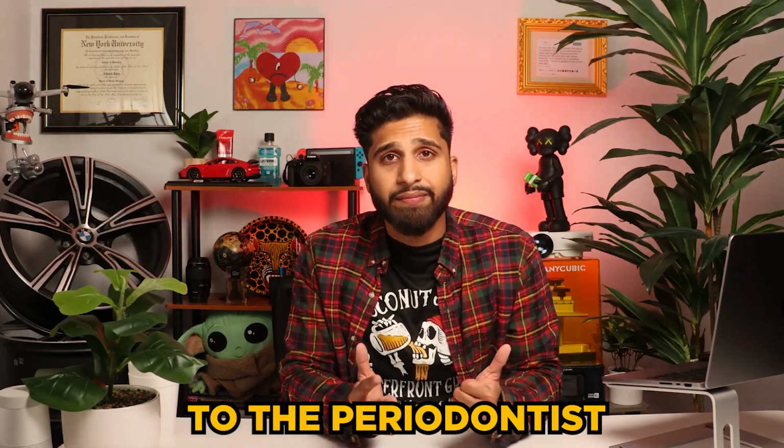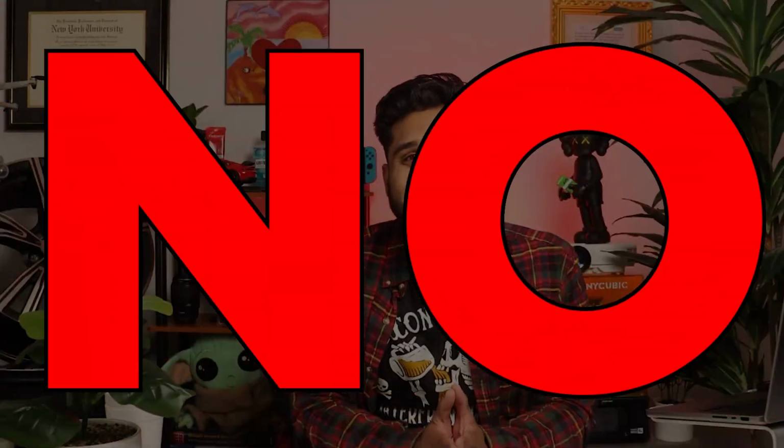Just close up the surgical site and refer the patient out to a periodontist, right? No! Don't worry. When you do enough of these cases, you simply know the next logical course of action to take to get the remaining portion of the tooth out.